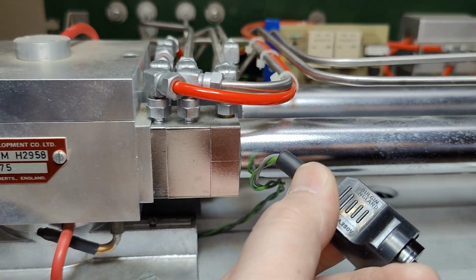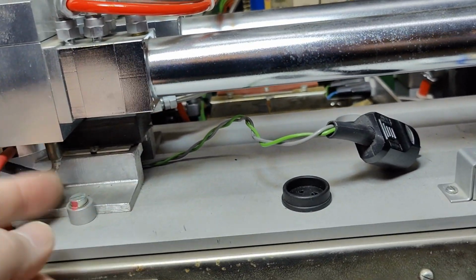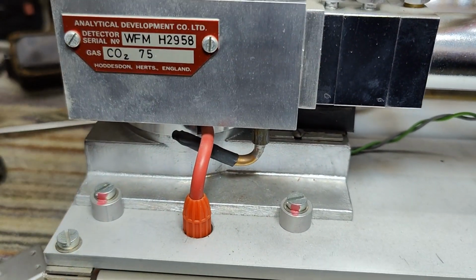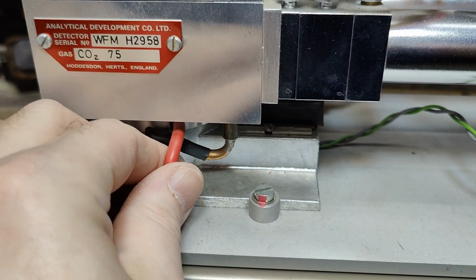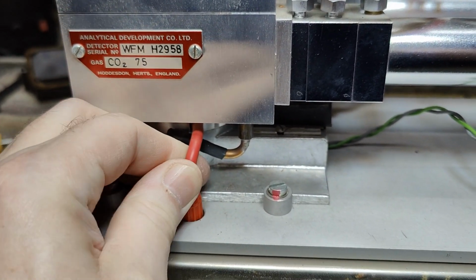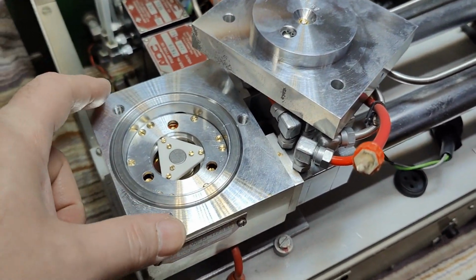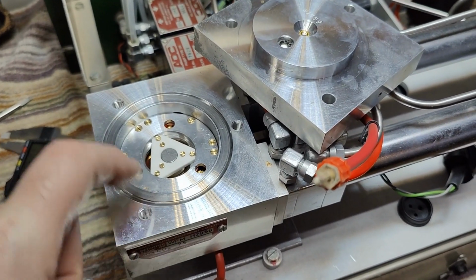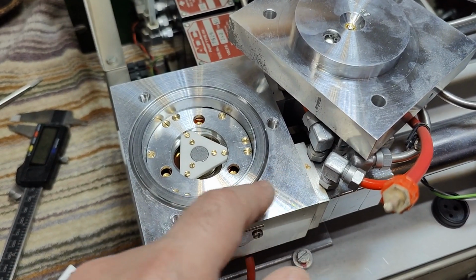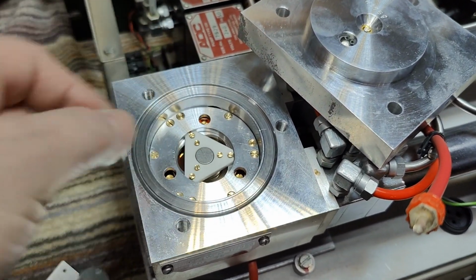We got another fancy connector here, and everything here looks like it is super old. What is that? So there's a cable going here. So this is probably the detector, right? Yeah, you can almost pull this cable. It was a little tough to get inside this unit, so I think this is definitely the sensor. I still haven't figured out, there must be some optical stuff that takes the measured signal from the two branches and goes in here, right?